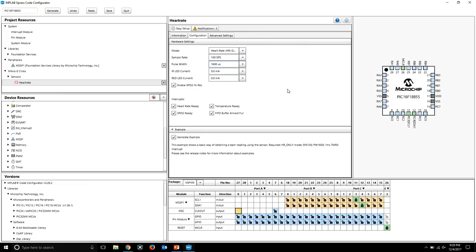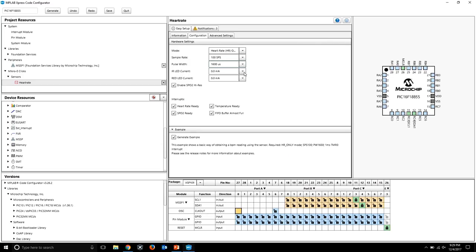Okay, I was going to ask that question. Is it for the actual Xpress evaluation board? It's for the click boards, actually. Okay. So this will give you the best resolution. Obviously, you can change these numbers around and change the resolution depending on the situation. Yes. Now the next two things are IR LED and red LED, which the maximum it supports is 50 milliamps. So we're just going to go 50 milliamps to get the best resolution possible. All right, so we're just going to get done with that.